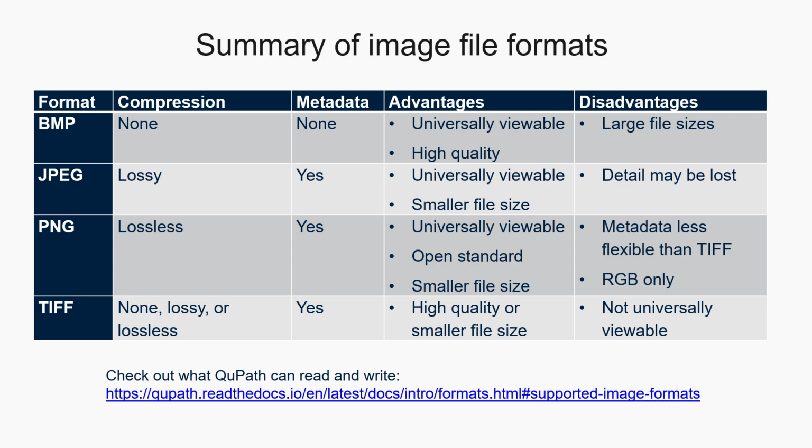TIFF is one of the most important formats in bioimaging. TIFF, or Tagged Image File Format, supports a variety of compression methods, preserves metadata, and can store high-quality image data suitable for analysis. As a result, TIFF and related microscopy formats are often preferred for storing scientific image data.